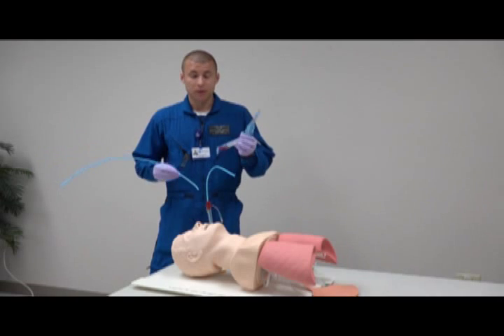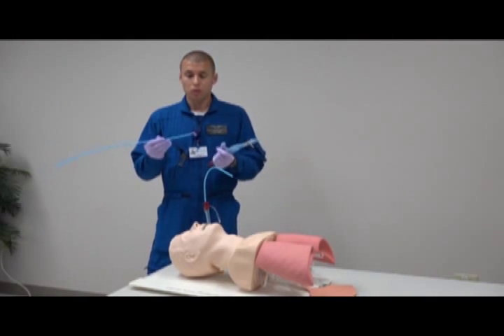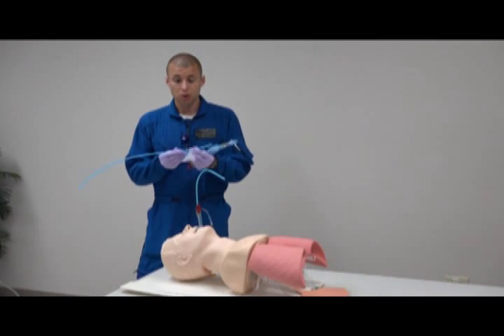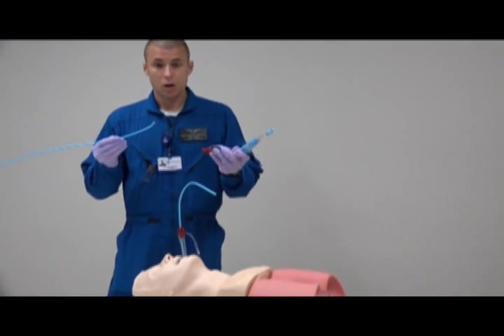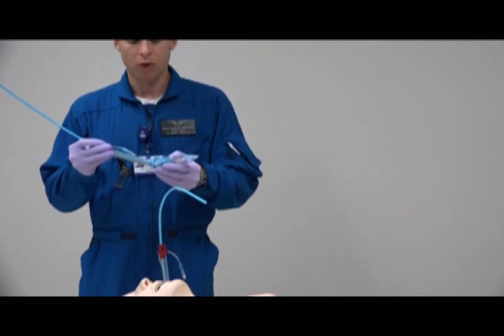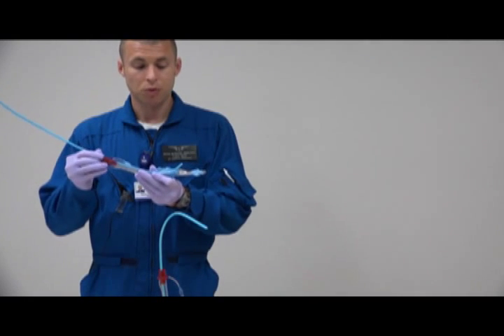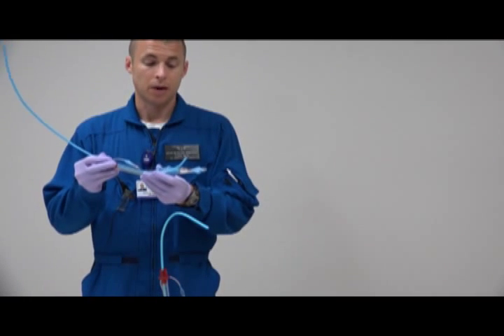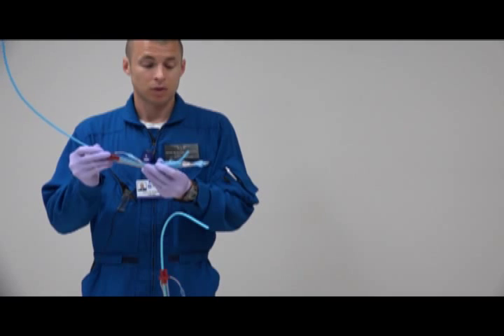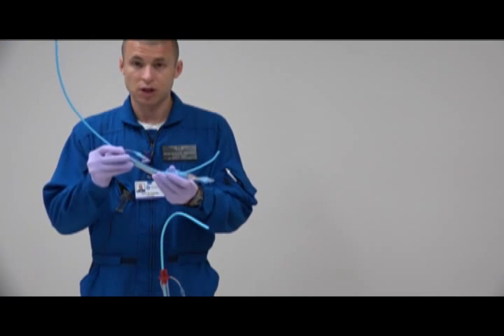The nice thing about the King LTD is that using the gum bougie — make sure your gum bougie is lubricated — you insert it through this distal port right here. Your goal is to have the gum bougie come through there and, if everything works out like it should, it's going to go into the trachea and you'll be able to exchange that out.